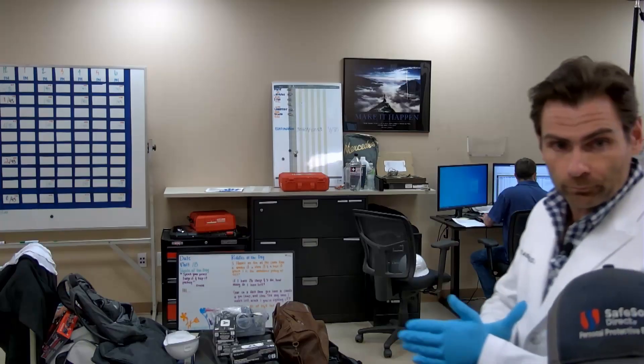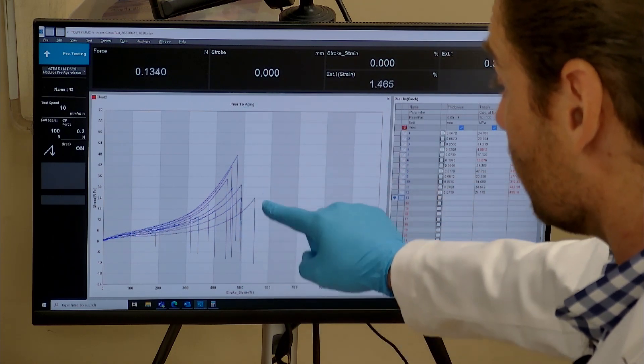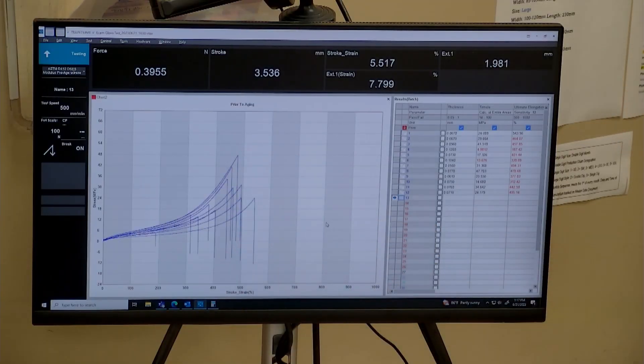Let's get on the machine. We're testing for two things: tensile strength and elongation. To meet ASTM D6319, we need to beat 500% elongation and a tensile strength of 14. We've only had one glove on here — a medical glove — that has beat that standard. There is a stipulation that if the glove is over six months old, it only needs to hit 400% or better. Buy new gloves, people.